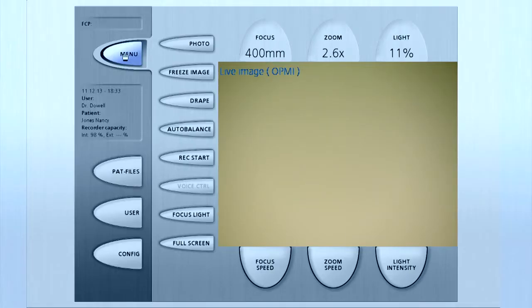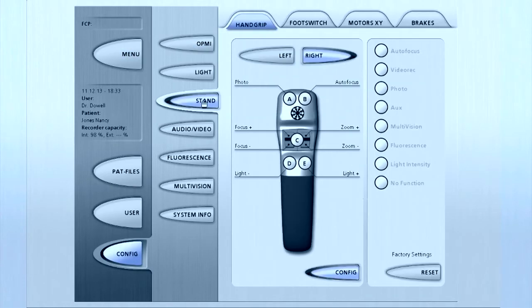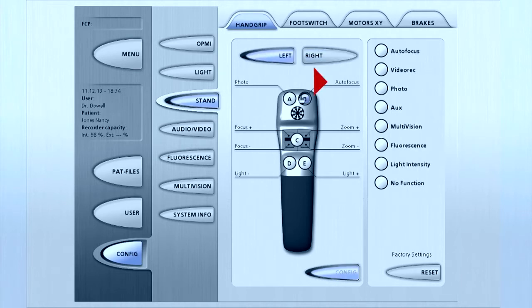To configure the hand grip, press Config on the main menu, then the Stand button at left, then the Hand Grip tab at top left, and then press Config at the bottom of the panel. Next, press the left or right buttons to select which hand grip you want to configure. For this user, the left hand grip's B button is being programmed to take a photo. The right hand grip's B button will enable fluorescence. The newly programmed functions will be displayed on the touch screen.